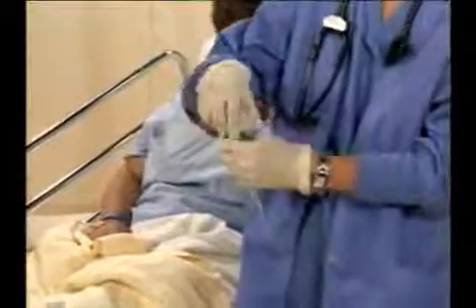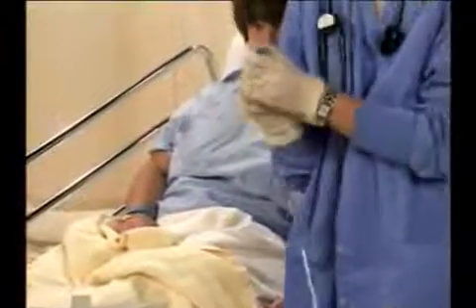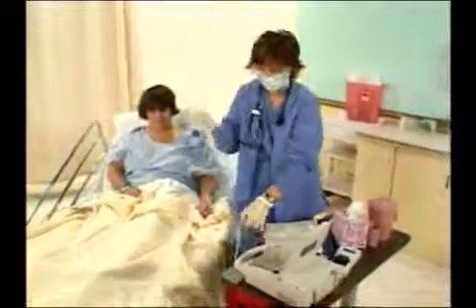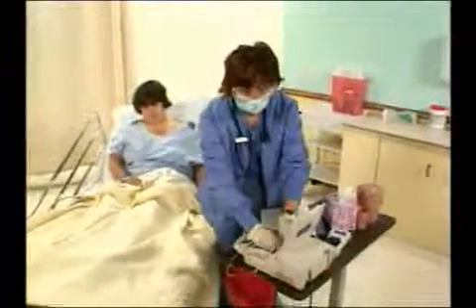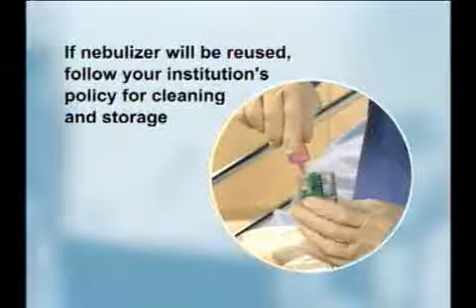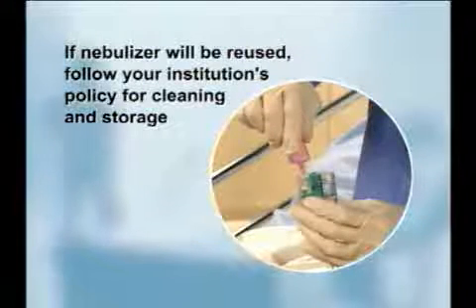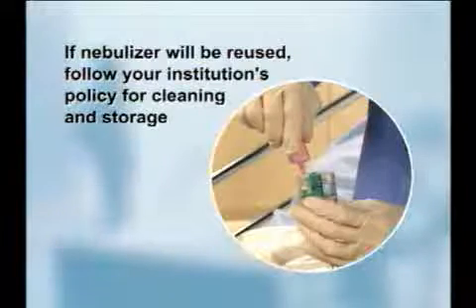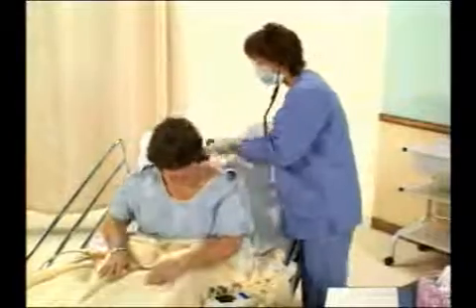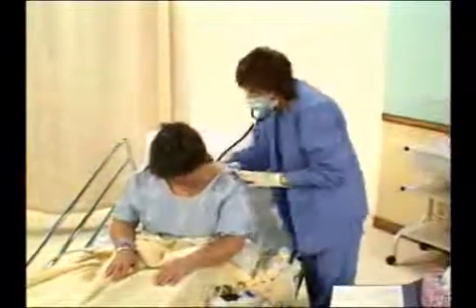Detach the tubing from the compressor and the nebulizer cup to prepare all the components for cleaning or disposal. If the nebulizer is disposable, dispose of it in the appropriate container. If the nebulizer will be reused for this client, follow your institution's policy regarding the cleaning and storage of the nebulizer components. Assess the client immediately following the treatment for results or adverse effects from the treatment.